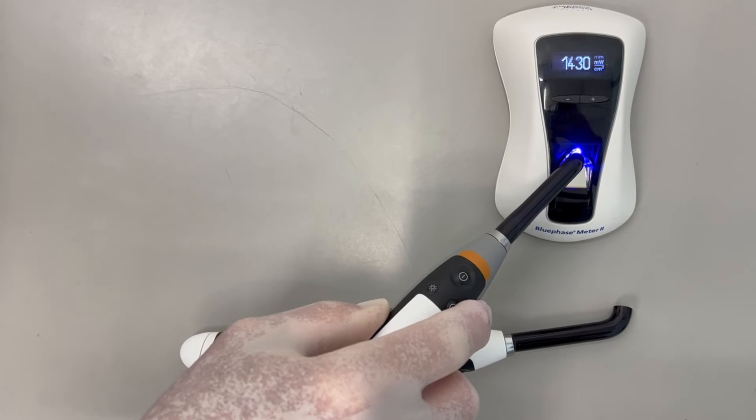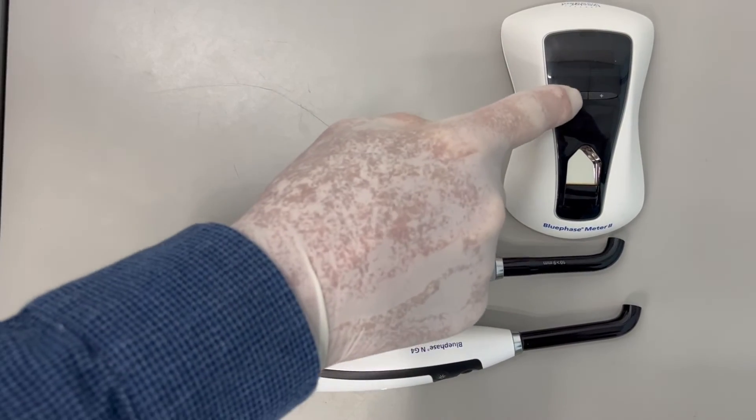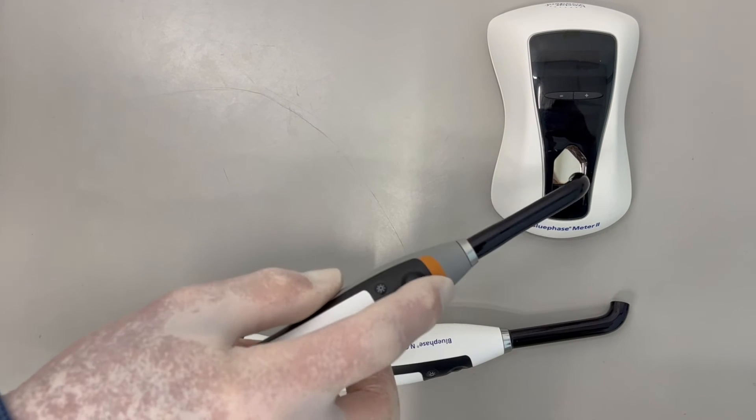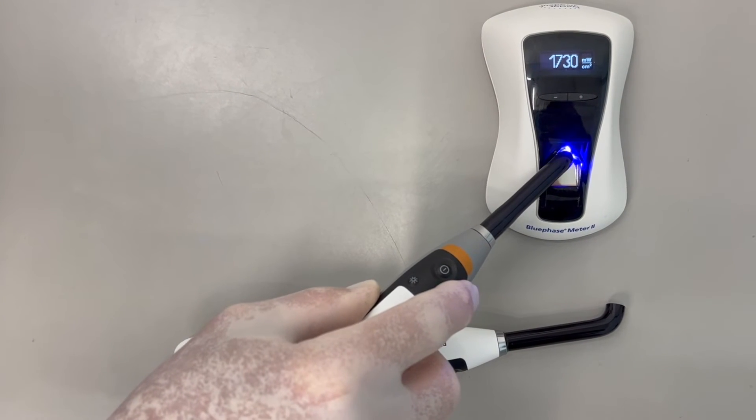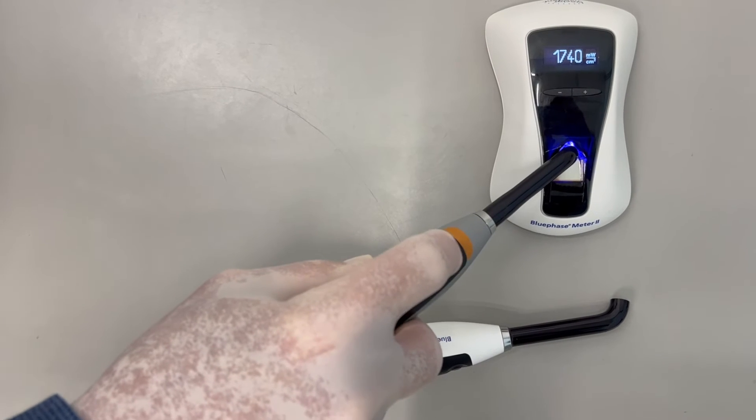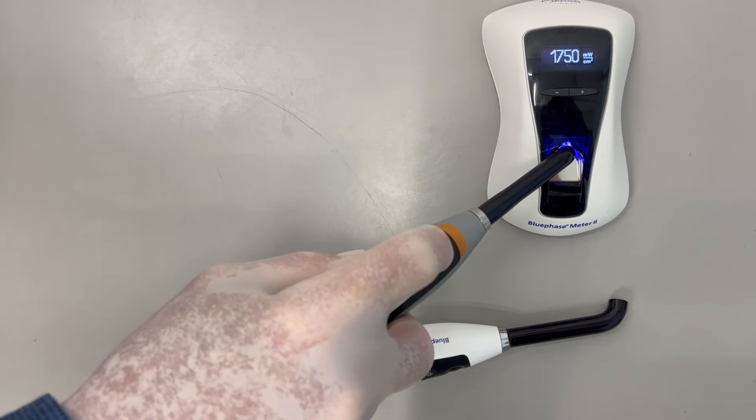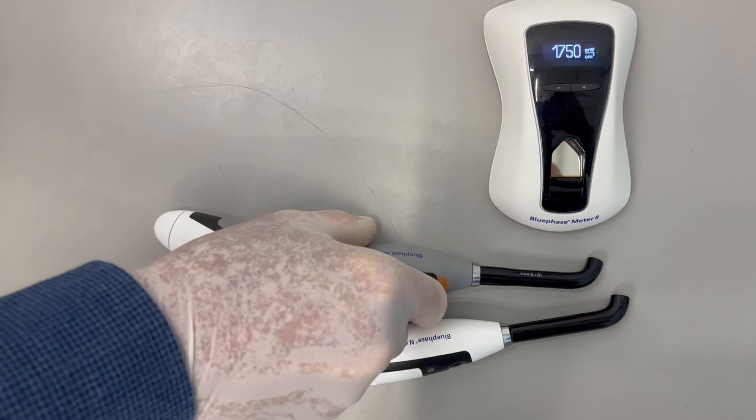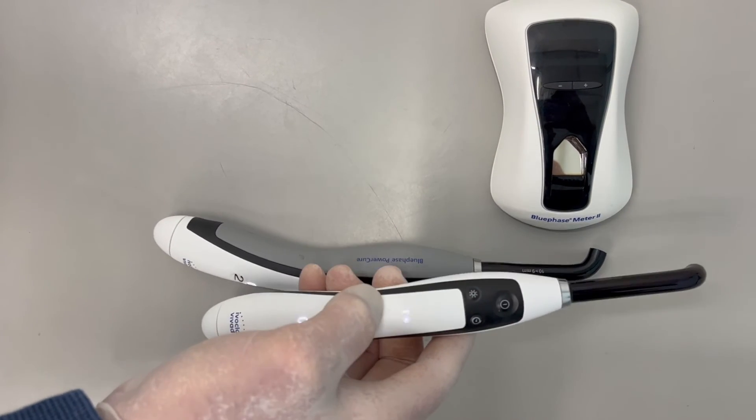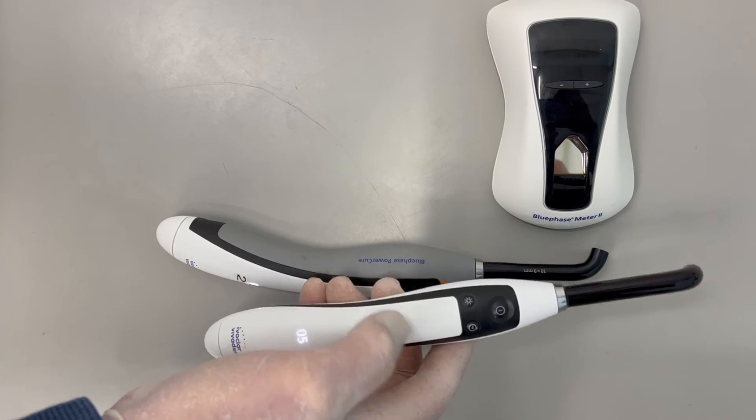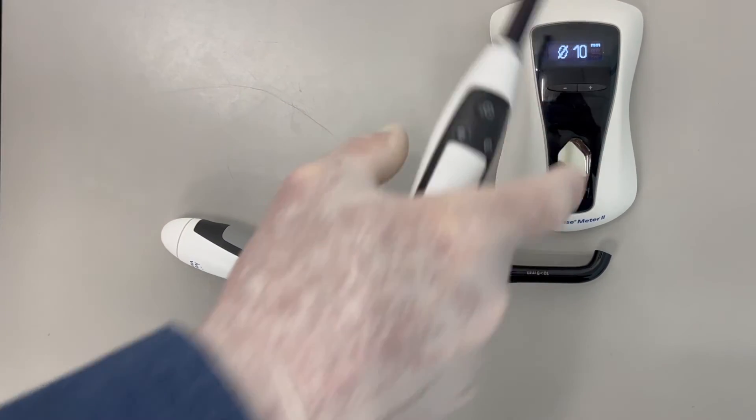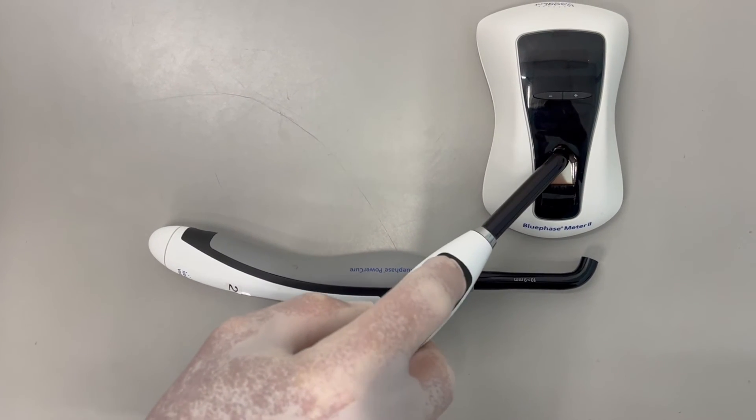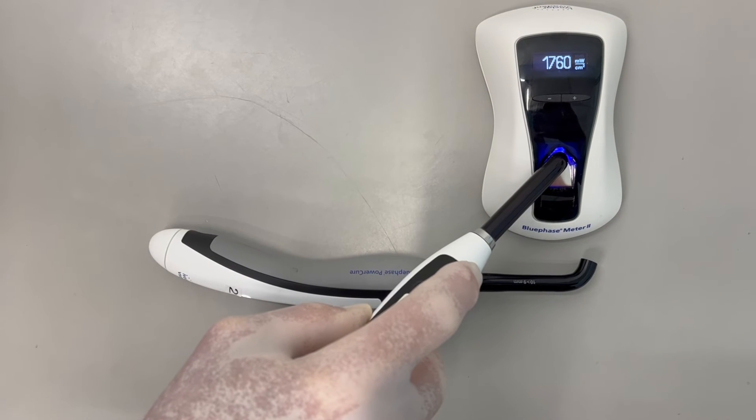When we set the tip diameter to 9mm, the irradiance is now 1750. This video shows the tip diameters between these two lights are slightly different: the PowerCure has a 9mm tip diameter, whereas the NG4 has a 10mm tip. Both curing lights deliver the same irradiance on high and turbo settings.